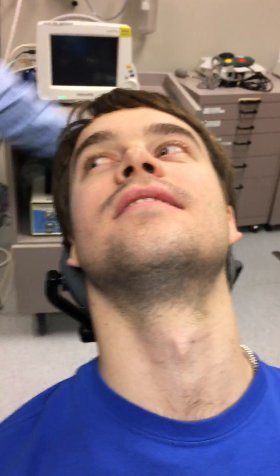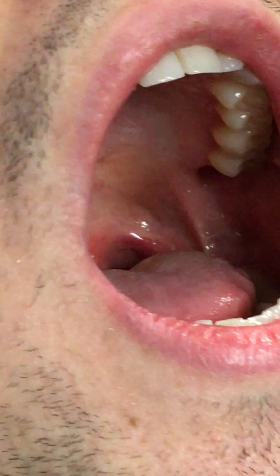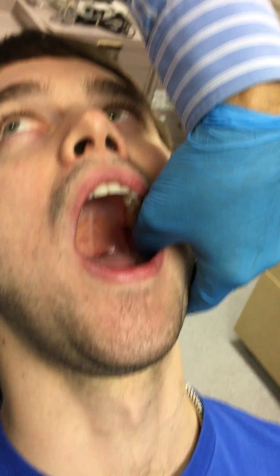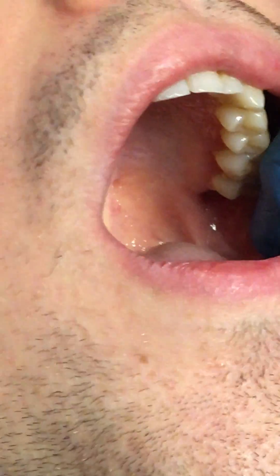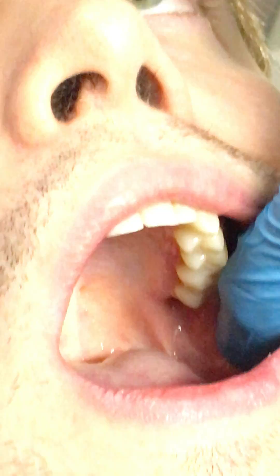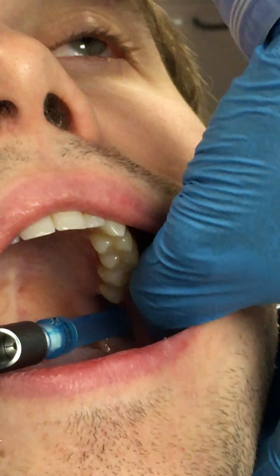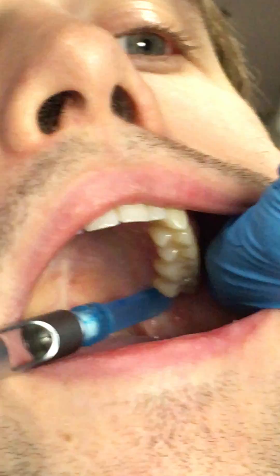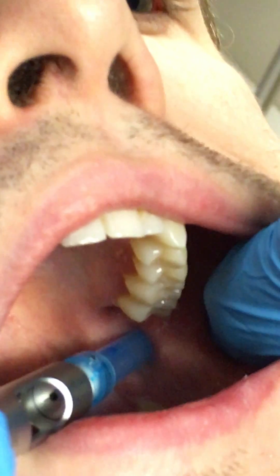Now it's hard to hold your mouth open like that. Is there anything you should palpate intra-orally for the Gow-Gates? I have my finger inside — as you open your mouth wide, your coronoid comes forward and down. So I'm feeling his coronoid come forward and down. I know this needle needs to be medial to the coronoid. By feeling the coronoid, I know I've got to be over here to be on the inside of it. The anterior margin of his coronoid is where my thumb is right now, and this is where I'm injecting.